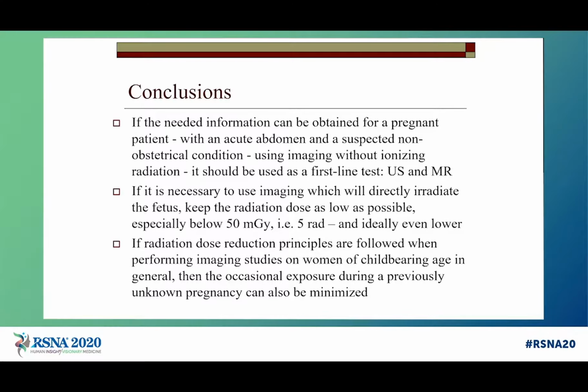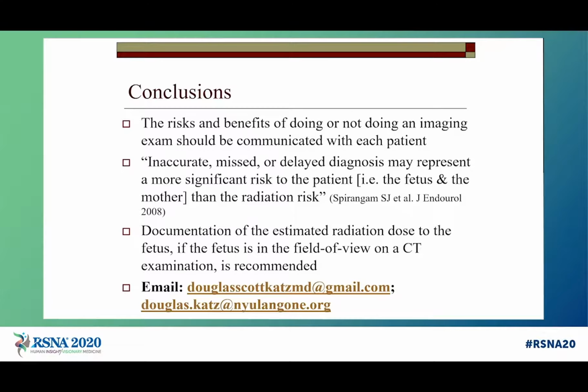And then finally, there are risks of not doing things. And so I like this quote I'll conclude with from the urological literature, quote, "Inaccurate, missed, or delayed diagnosis may represent a more significant risk to the patient, i.e. fetus and mother, than the radiation risk." And then if we do have to use CT, we want to document the estimated radiation dose, include that in a report if necessary, get medical physics involved.